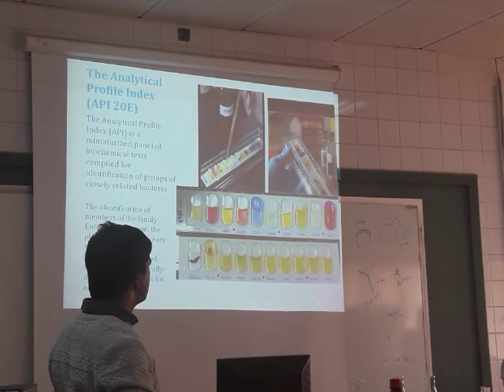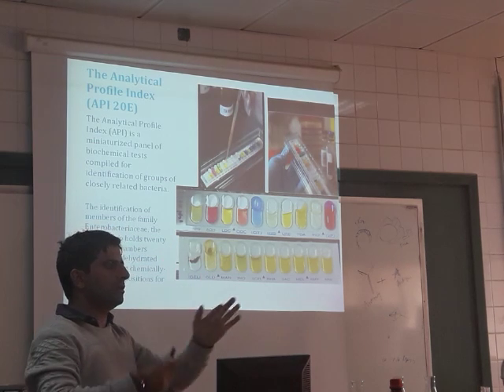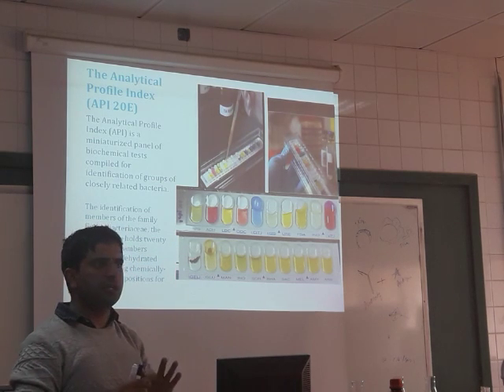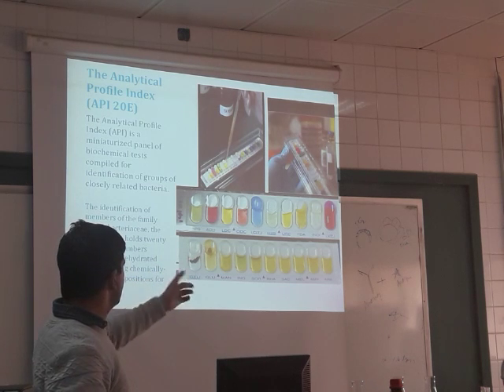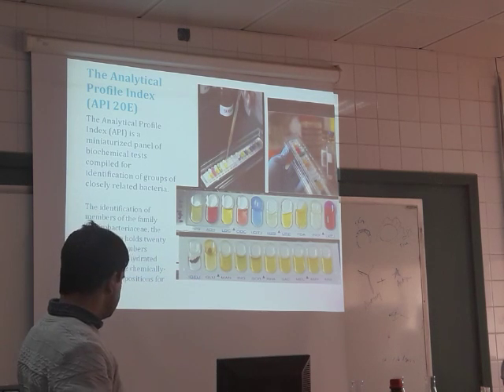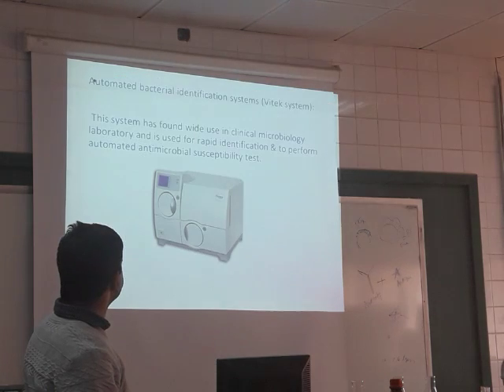Forget about this picture. What is this picture? This is in vitro tests: methyl red test, glucose test, sugar test, urease test, all tests together. So we have discussed them one by one.